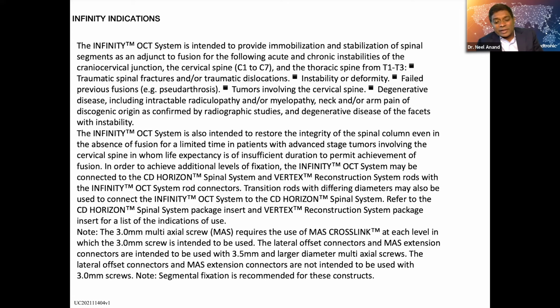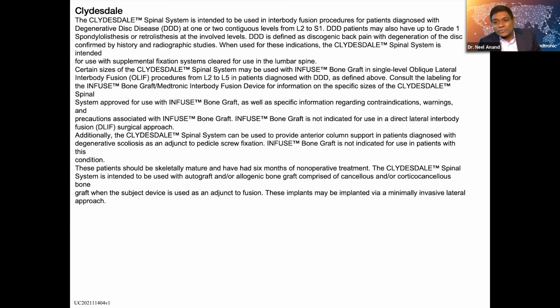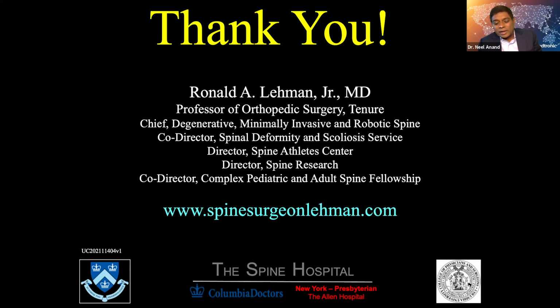And the other thing I think a lot of people should take home is the ability to do a TLIF in spite of a posterior fusion mass. Just osteotomize through that mass and you get your TLIF. It still is an interbody fusion. And in my eyes, much better than 3-column osteotomy. So the biggest message for me that you gave is, look for that free disc. If there's a disc, go for it. And you can do it through TLIF. And TLIF is a great operation.